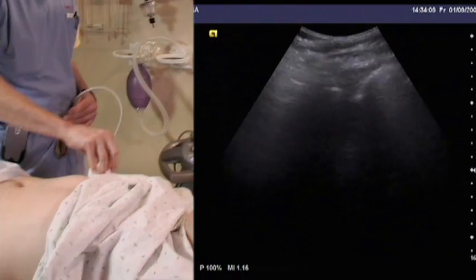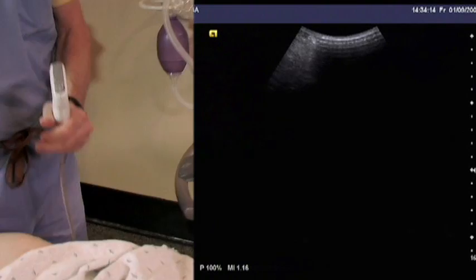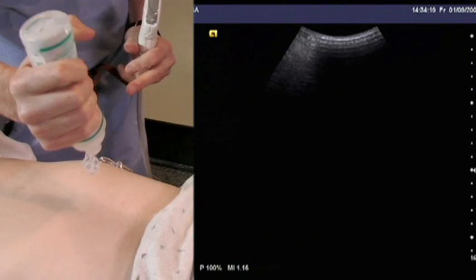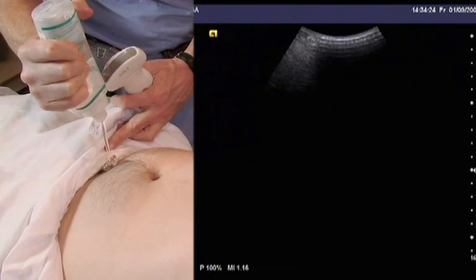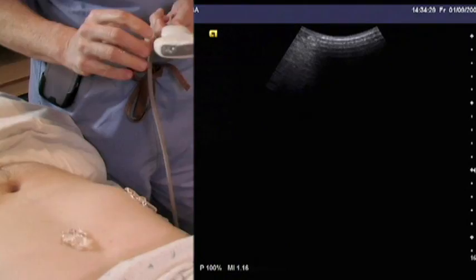One can go in any order, but it's appropriate to go in the same order every occasion so that by using an absolutely routine method, one doesn't miss or overlook anything. In the right upper quadrant, we most often use the intercostal window. When starting the FAST exam, since speed is important, we usually apply ultrasound gel in each of the four locations we're going to scan prior to starting so we don't need to be concerned about that during the exam.